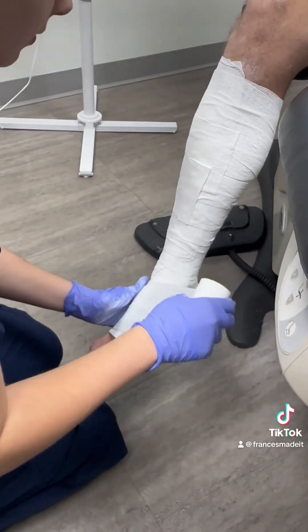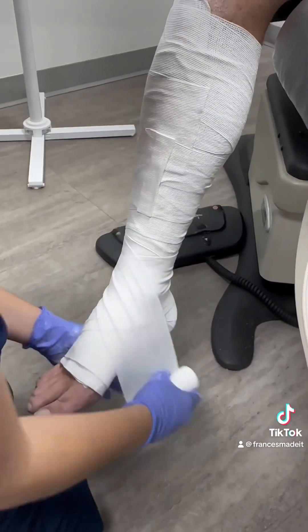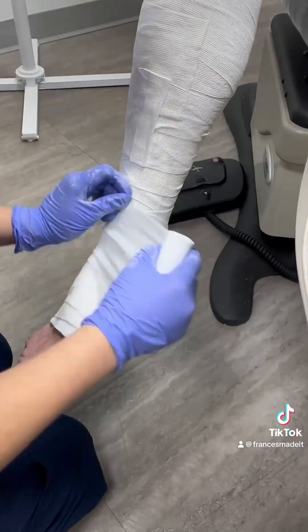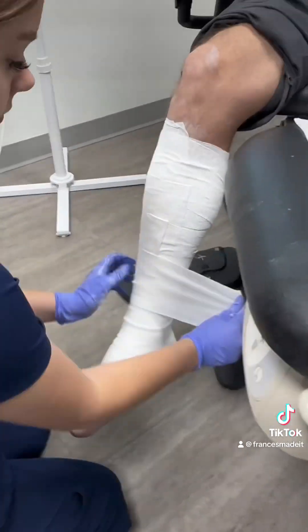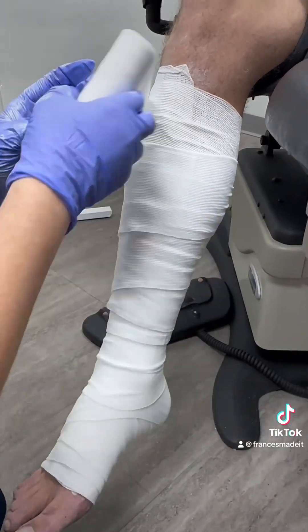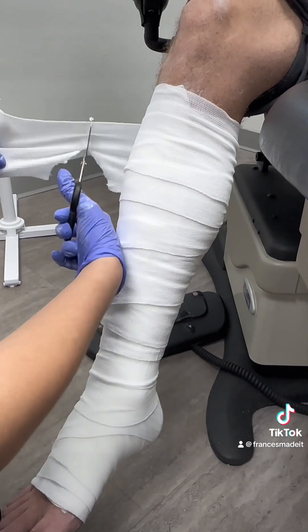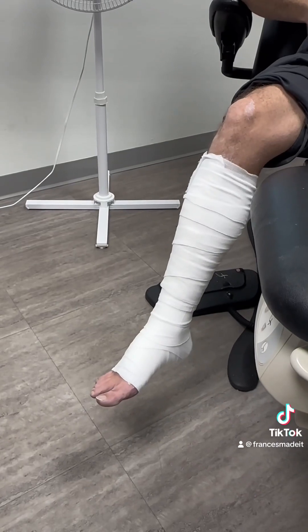Here you can see she is using a conforming gauze, also known as cling, to do a figure-eight wrap up the extremity. If you find yourself finishing up with a cling, just grab another one. What we recommend is: where you finish off is where you start, to continue wrapping up the leg. You can cut off any extra if necessary, or finish off the row.